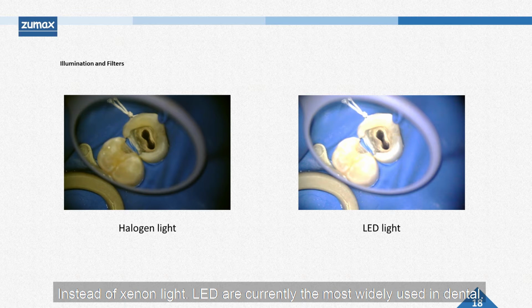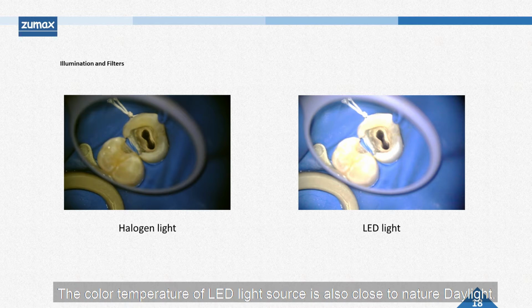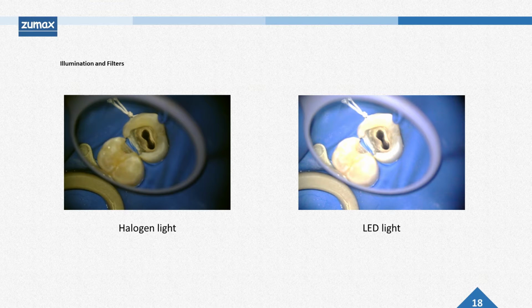Instead of xenon light, LEDs are currently the most widely used in dental. The color temperature of LED light source is also close to natural daylight, but the light intensity is weaker than xenon light. The biggest advantage of LEDs is their long service life, usually reaching 70,000 hours.